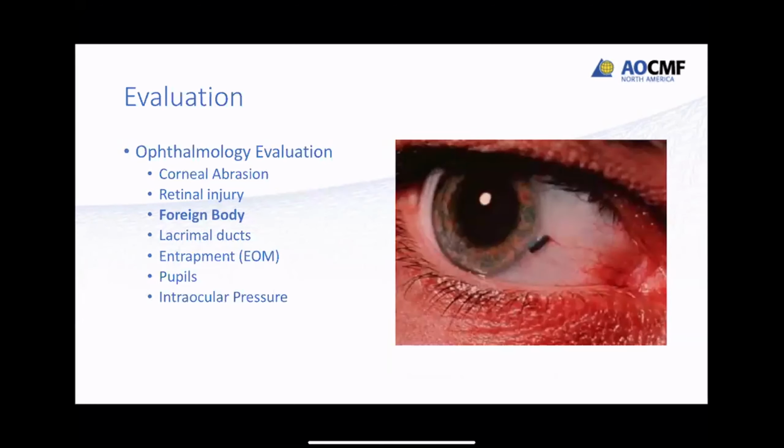Of course, there's foreign bodies which you need to look at. These are actually pretty easy to flake out. You want to be careful, particularly if you're right on the iris, but you should remove these if you possibly can. You can leave them for later on, but they're going to cause a lot of inflammation, and it's going to necessitate a secondary procedure by the ophthalmologist, typically to remove it.